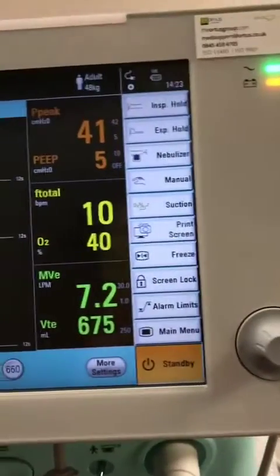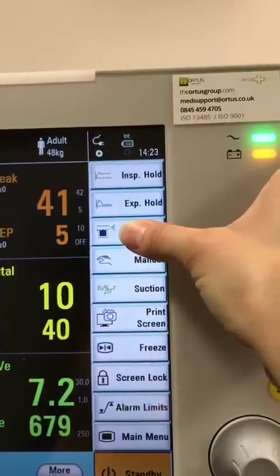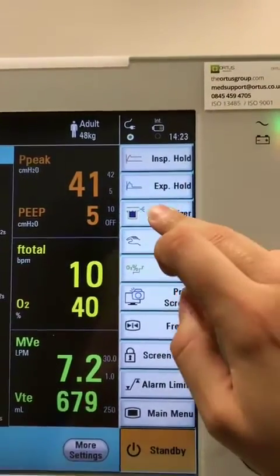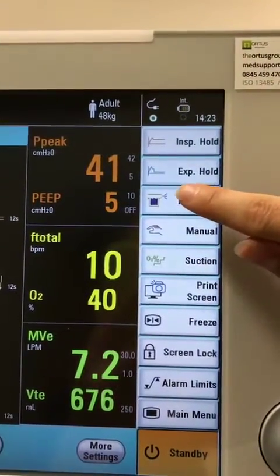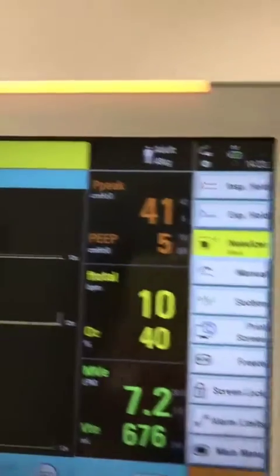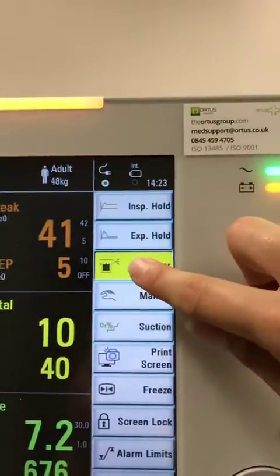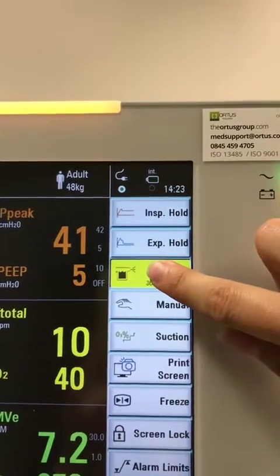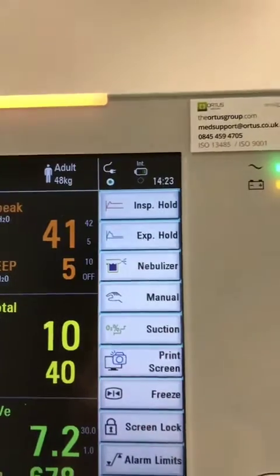There are two quite important things to note. The nebulizer function — if you try and press it, it doesn't actually work. What you actually need to do is put your finger and hold, and it will flash a few times and then start. Then again, press and hold for a few seconds and it will stop.